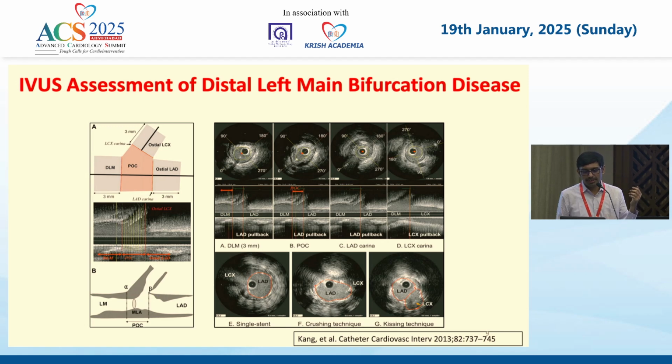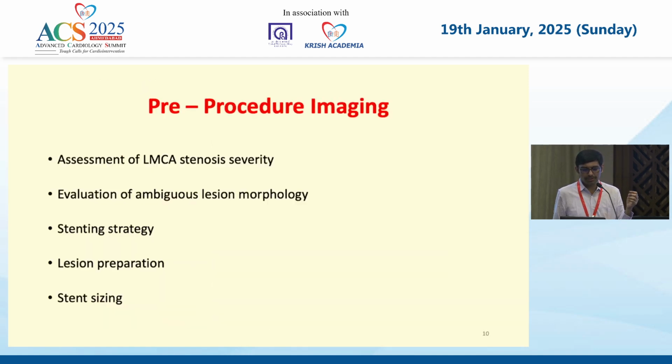So the segment from the first frame of the figure of 8 to the proximal 3 mm is called the ostium of the distal main vessel. And in the side branch pullback, from the figure of 8 frame to 3 mm distal, it is called the ostium of the side branch. And in main vessel pullback, the area between the figure of 8 and the inflection point of your side branch is the area of polygon of confluence. That is how the IVUS segmentation of left main bifurcation happens. It is almost similar to what you do with the bifurcation QCA.